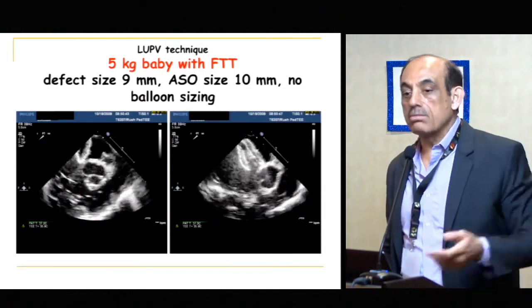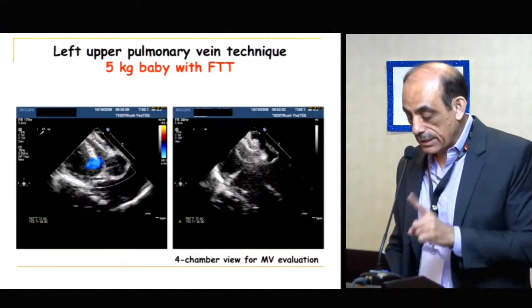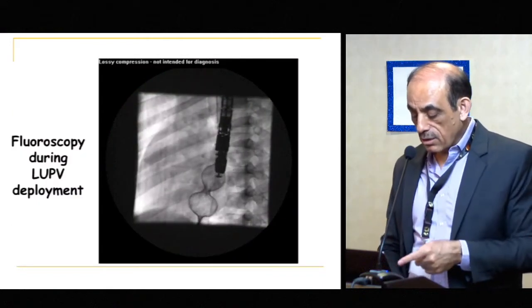Very, very quick. Boom, and it's done. Again, check the mitral valve. It's a large ASD. Check the mitral valve. Okay, this is how it should look on fluoro.